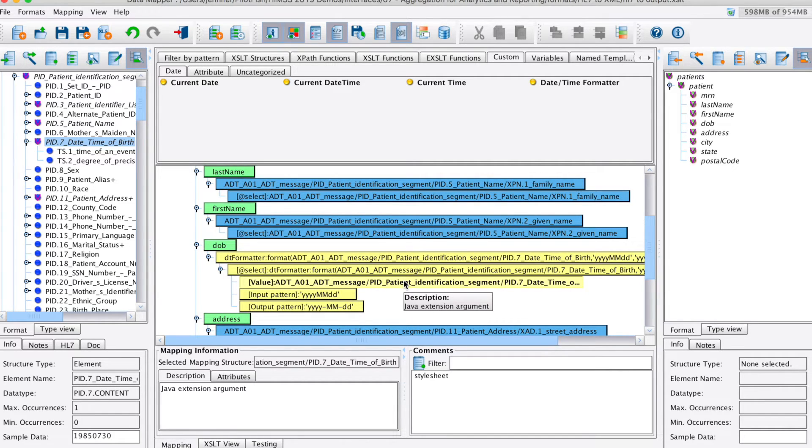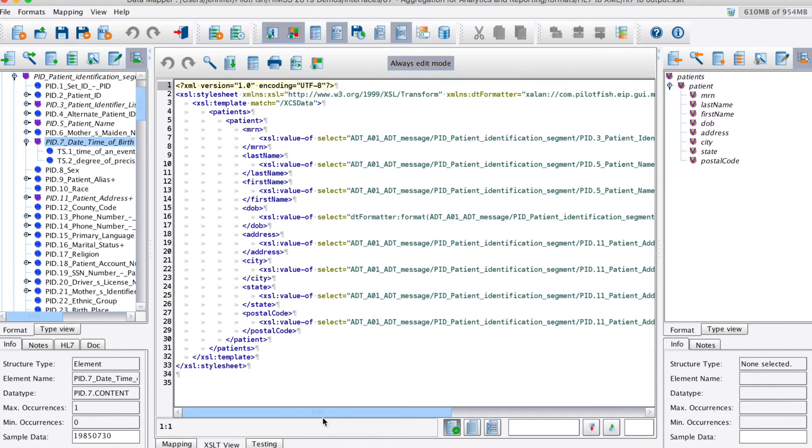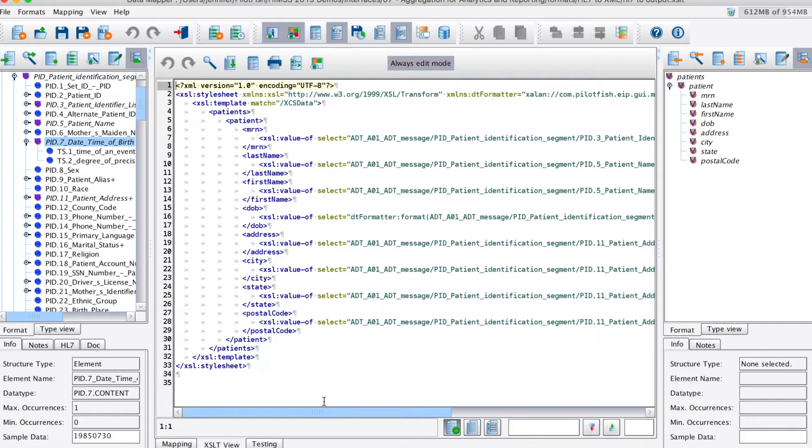As this mapping was created, XSLT was generated under the covers. Once all of our fields have been mapped and our mapping is complete, we can move on to the routing stage.